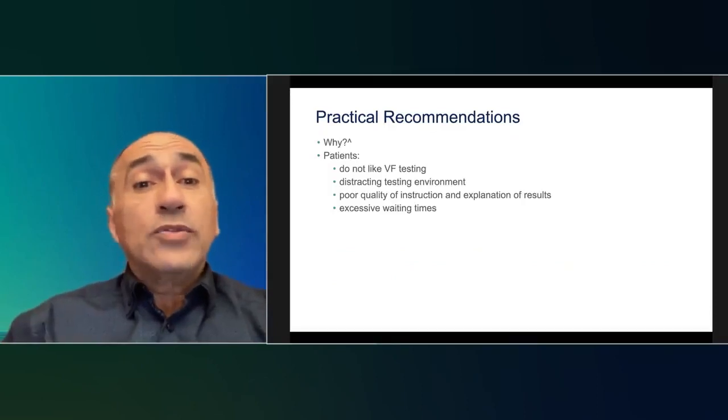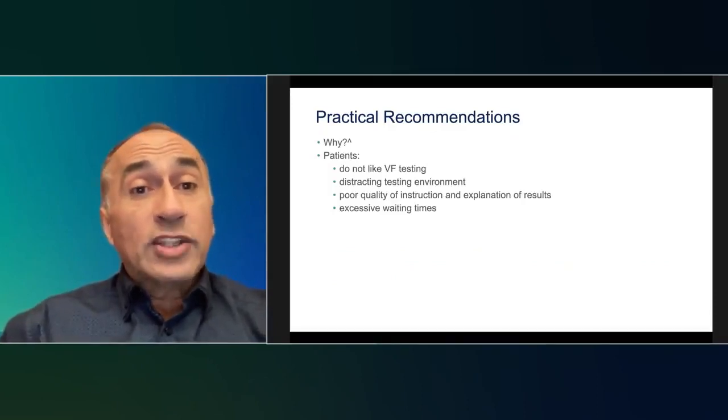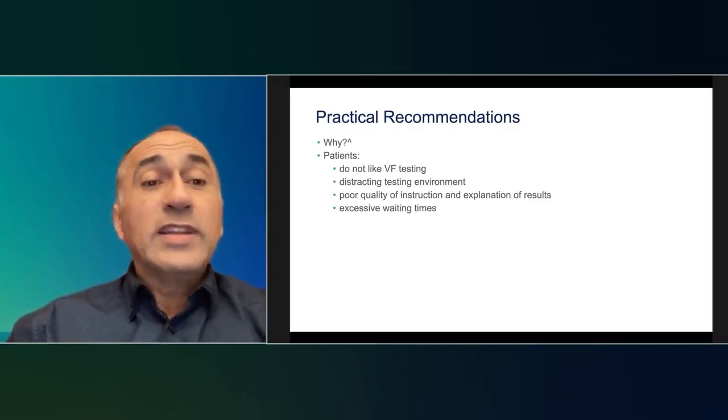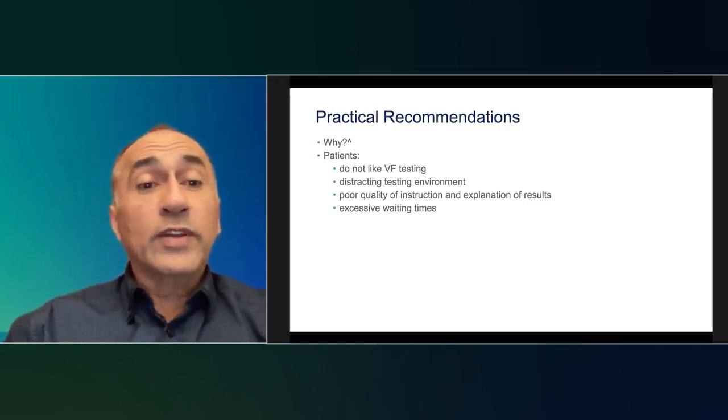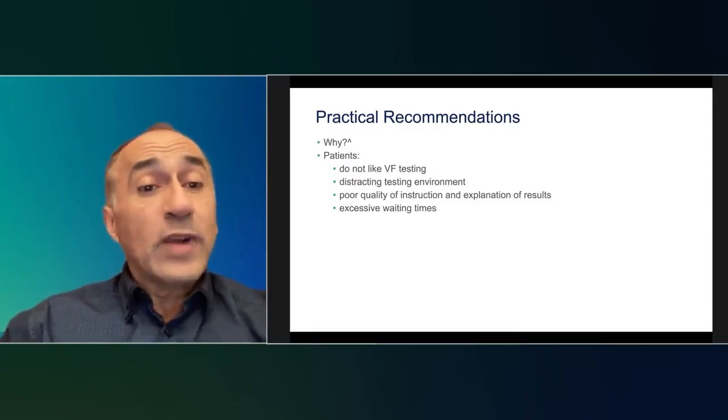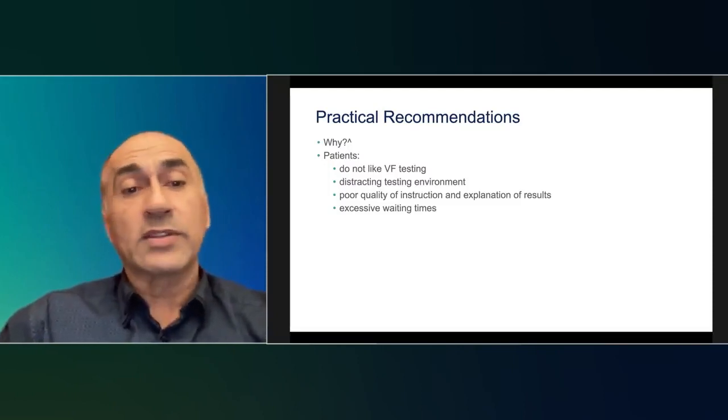And they looked into the reasons why the recommendations weren't followed. And they surveyed patients and they surveyed the doctors. The reasons patients didn't like coming for visual fields, they don't like the test itself, they don't like the test environment. They found that they weren't secluded enough. There were people walking past them, there were noises and lights going on. They felt distracted. They felt that the person running the test gave them poor quality instructions and at the end failed to explain the outcome of the results to them.